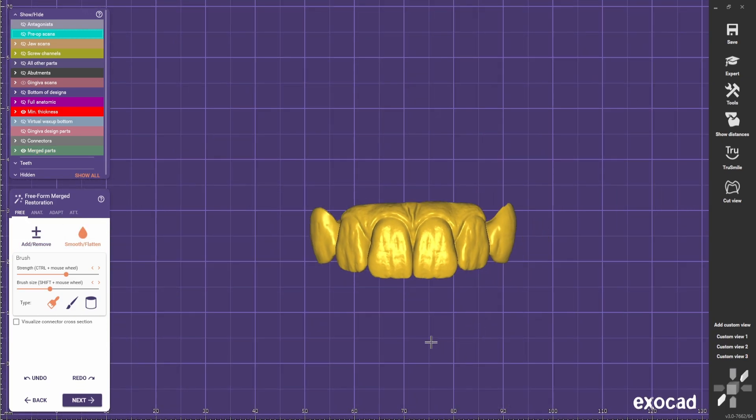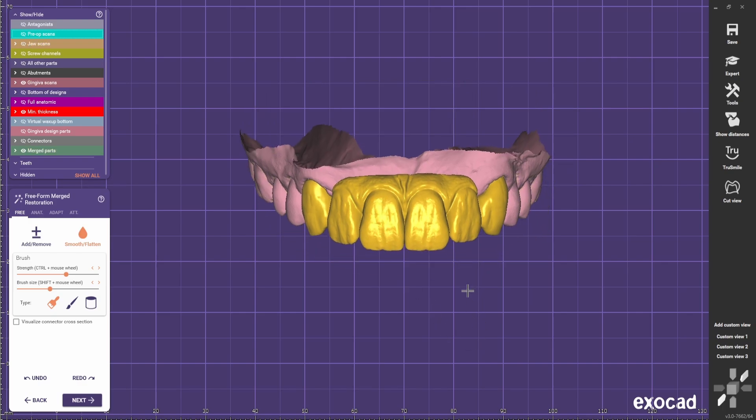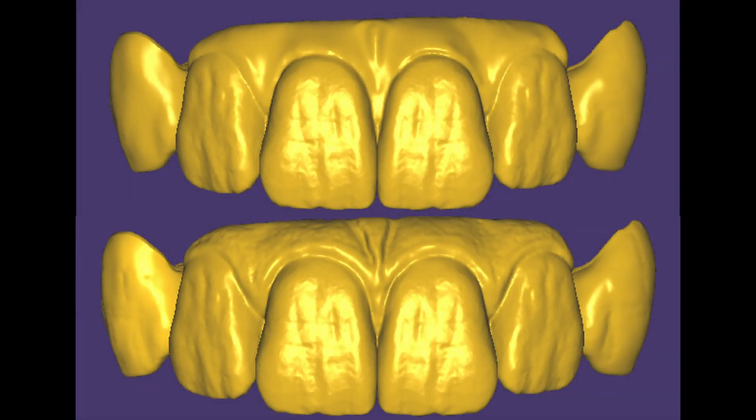And that's it. This is how I do a very realistic gingiva in Exocad.